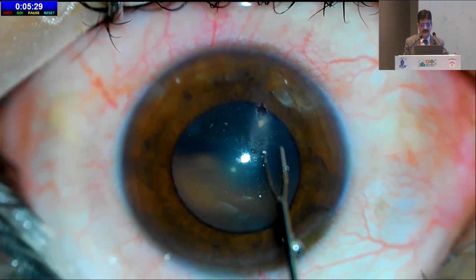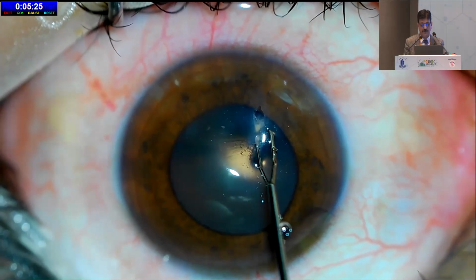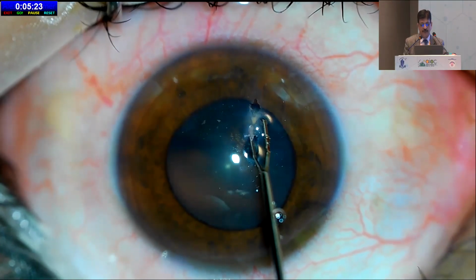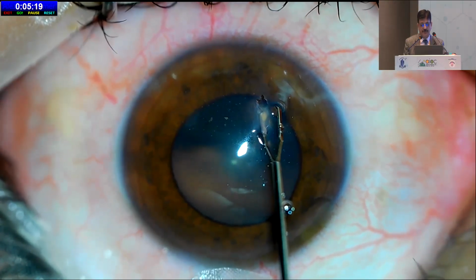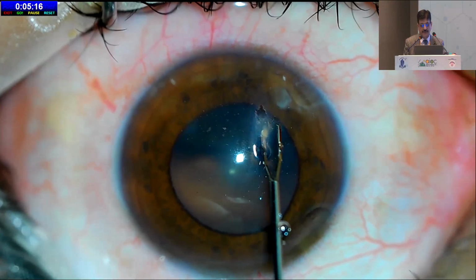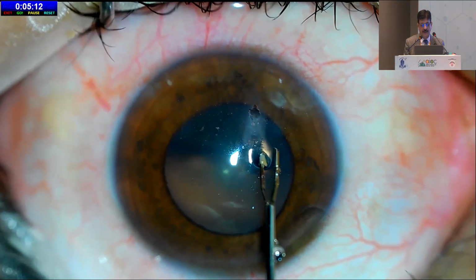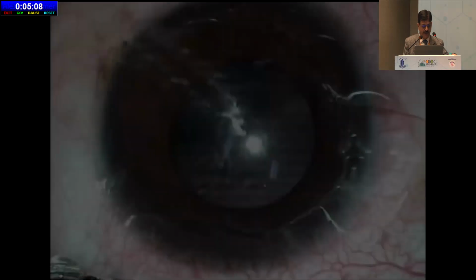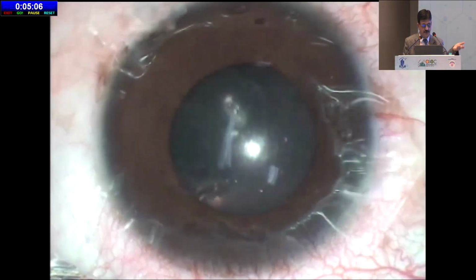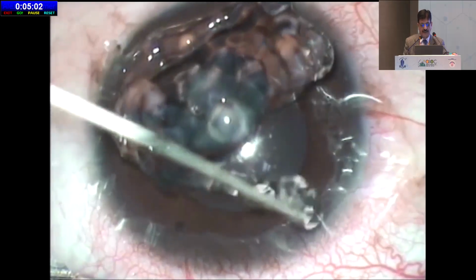So an idea struck that we have retinal foreign body forceps which our retina colleagues use to remove intraocular foreign bodies. I introduced one limb of this forceps and engaged the foreign body into the concavity of the forceps, and taking care not to let it go out and break, we removed it in toto. Care should be that once you are removing, you keep on pressing the foreign body onto the anterior stromal layer so that it doesn't come out of that concavity.